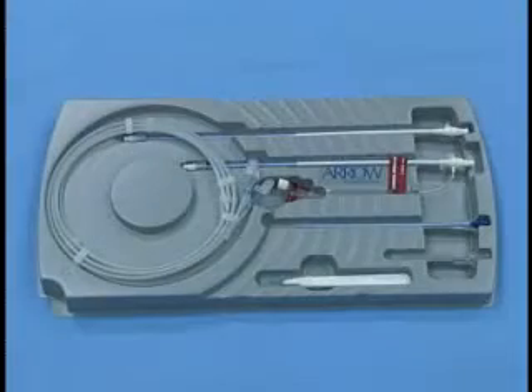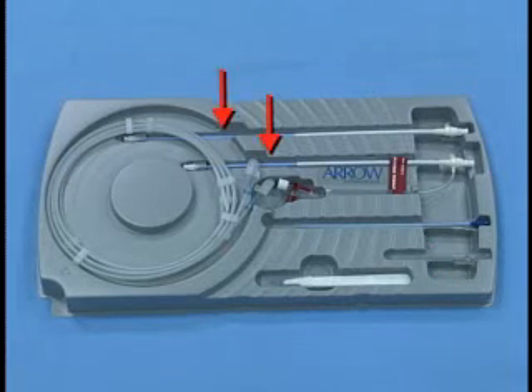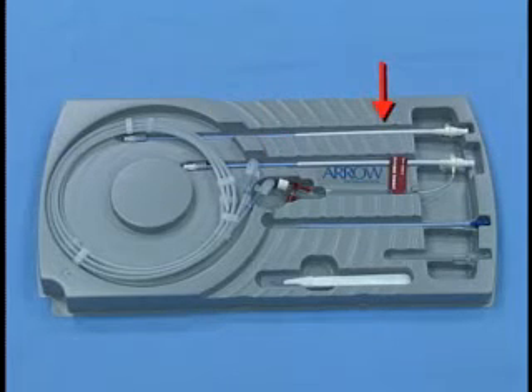The insertion kit contains one number 11 scalpel blade and handle, one 18-gauge arterial needle, one pre-dilator, two dual taper sheath dilators, one Teflon sheath introducer, one sheath introducer with side port for arterial blood sampling convenience, and two Teflon coated guide wires.